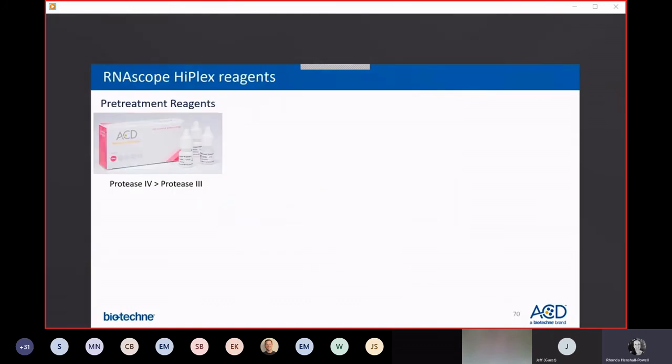Here's pictures of how the HiPlex reagents are kitted together. You have your pretreatment reagents. There's a couple of different flavors of protease. With this kit comes protease 4 and protease 3. In terms of relative strength, protease 4 is harsher, stronger than protease 3.